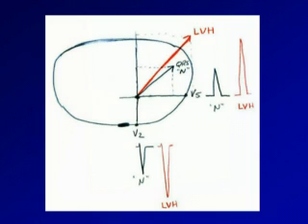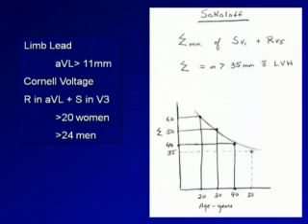And when I was talking about posterior rotation of the QRS, I'm talking about in the horizontal plane. Since the left ventricle is depolarizing back towards the scapula, the leads that get to see it, V5 and V6, are going to see their R wave grow in height. Meanwhile, the leads on the other side of the coin, V1 and V2, see their S wave increase its depth. Now, that combination of observations has given numerical values that allow you to assign voltage evidence of LVH.